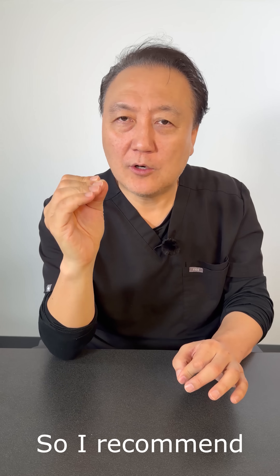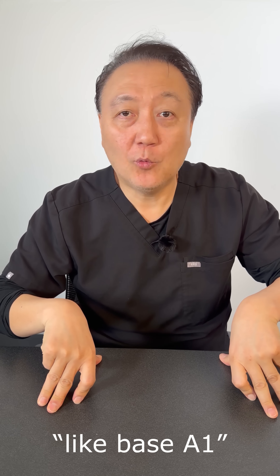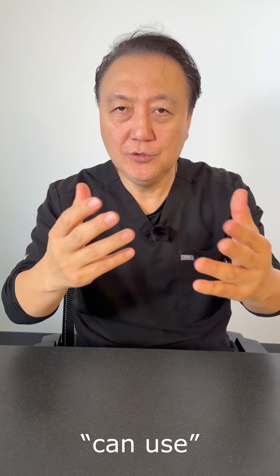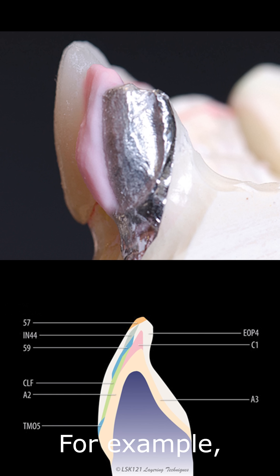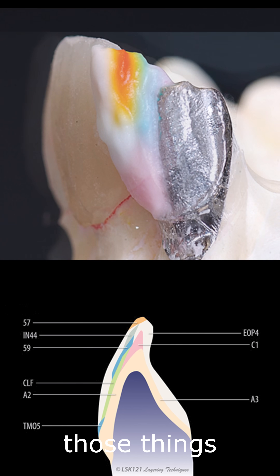I recommend the doctors to tell their lab: look, this is like base A1, but you can use your creativity. For example, you can use enamel translucency, mamelons, halo — those things. Use them. That's awesome.